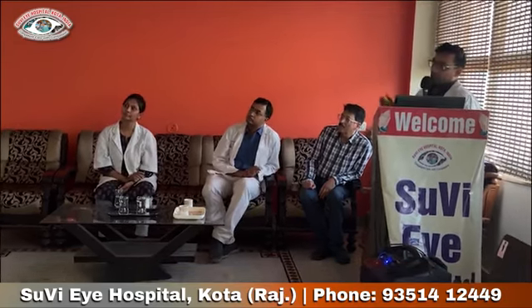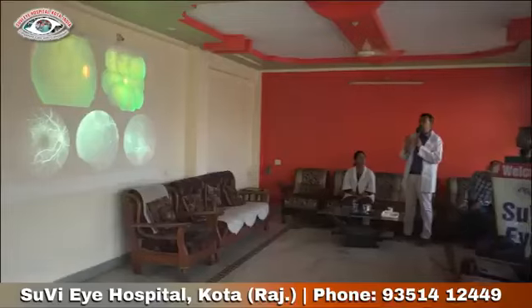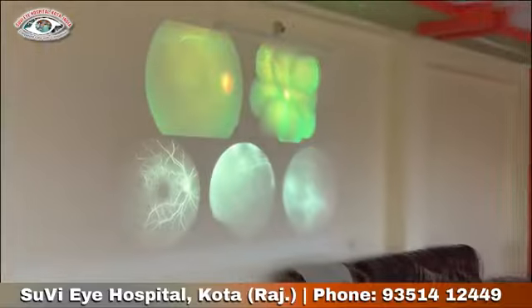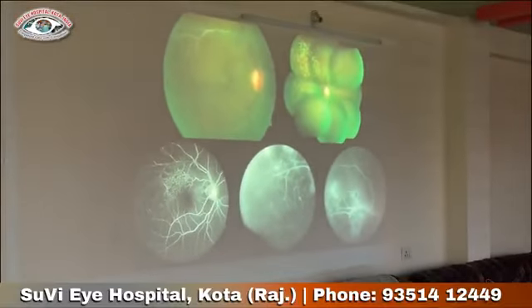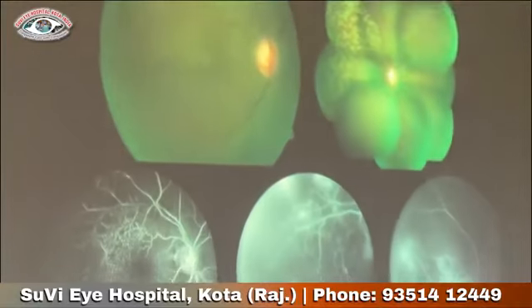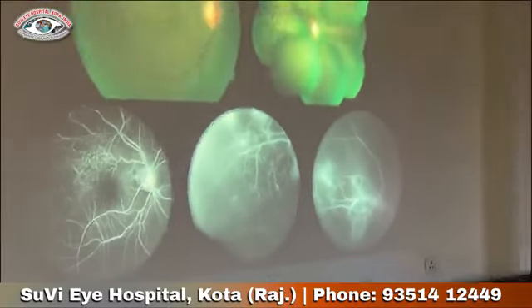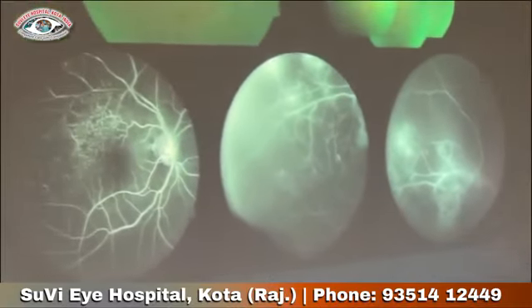Especially in case of vasculitis, or in case of BRVO, you can see on the fluorescein angiography if it is showing the CNP areas, then over the CNP areas PRP has to be done. The practical point you should remember is, if there is a sclerosed vessel, that means it's an old vein occlusion. The sclerosed vessel will correspond to the capillary non-perfusion areas. So you have to cover the sclerosed vessel as well, and 1 to 2 disc diameters adjacent to the sclerosed vessels also you need to cover.